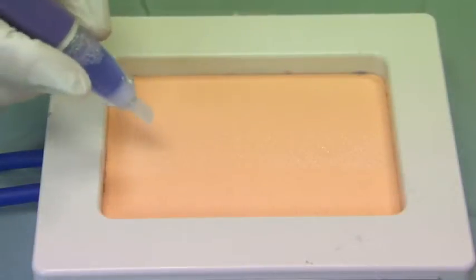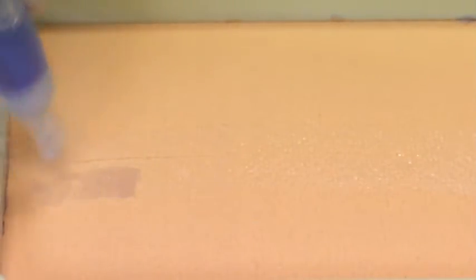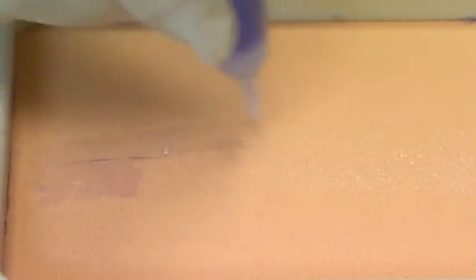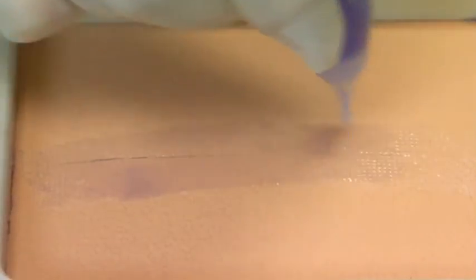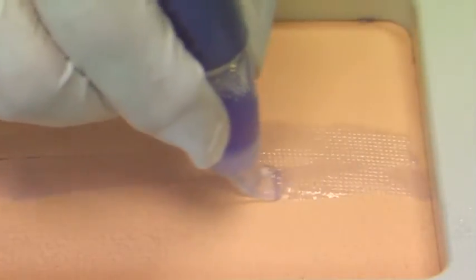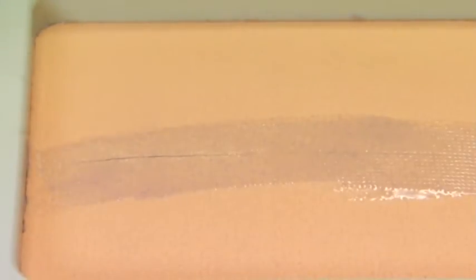To apply the adhesive, we gently squeeze the bulb to release the material in short strokes along the mesh, fully saturating the mesh. The initiator for the adhesive is contained within the mesh, so any runoff of the adhesive won't become firm, hard, or set up.